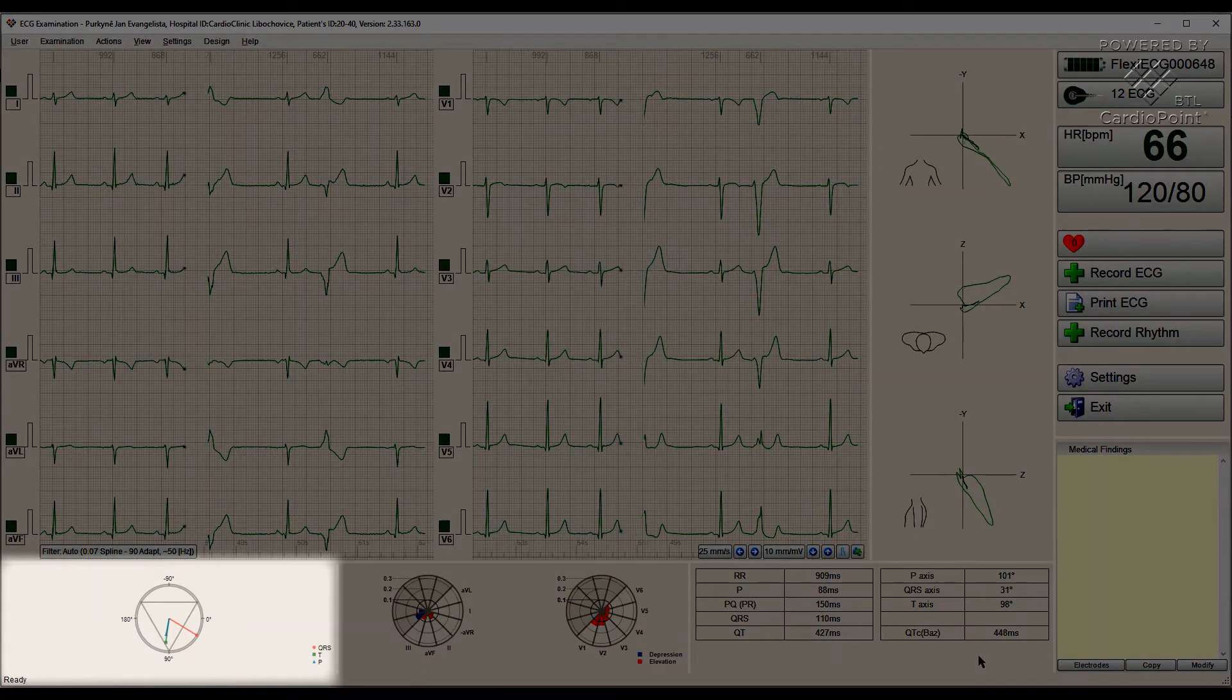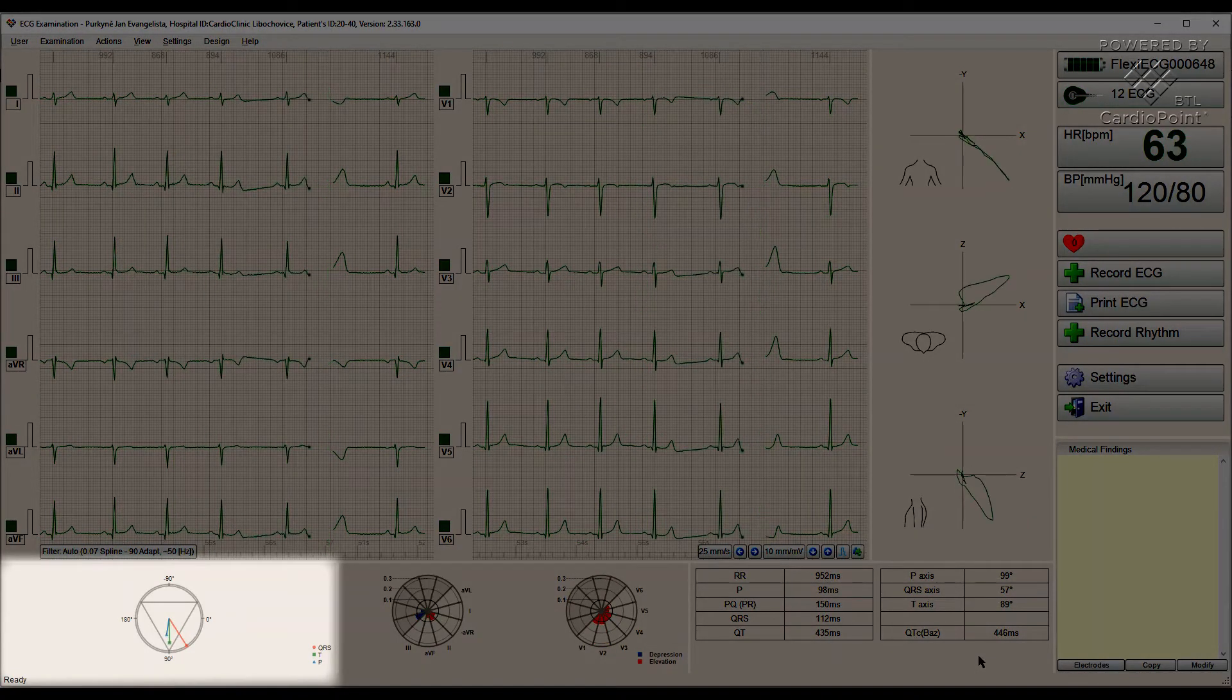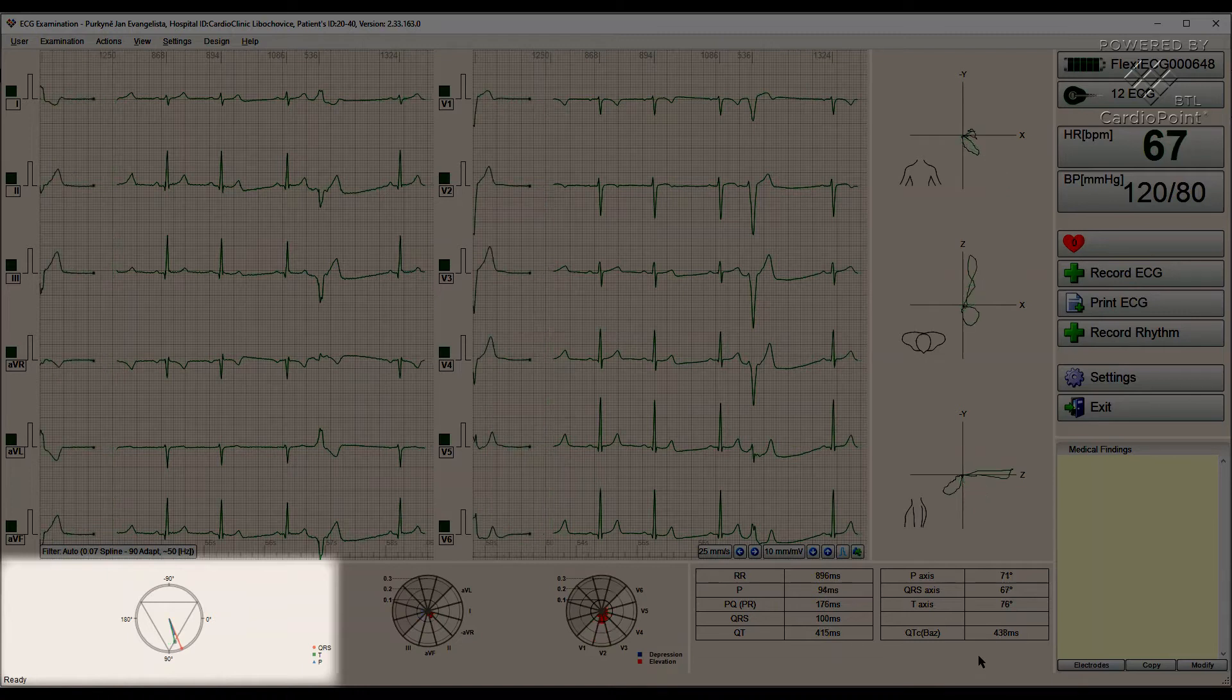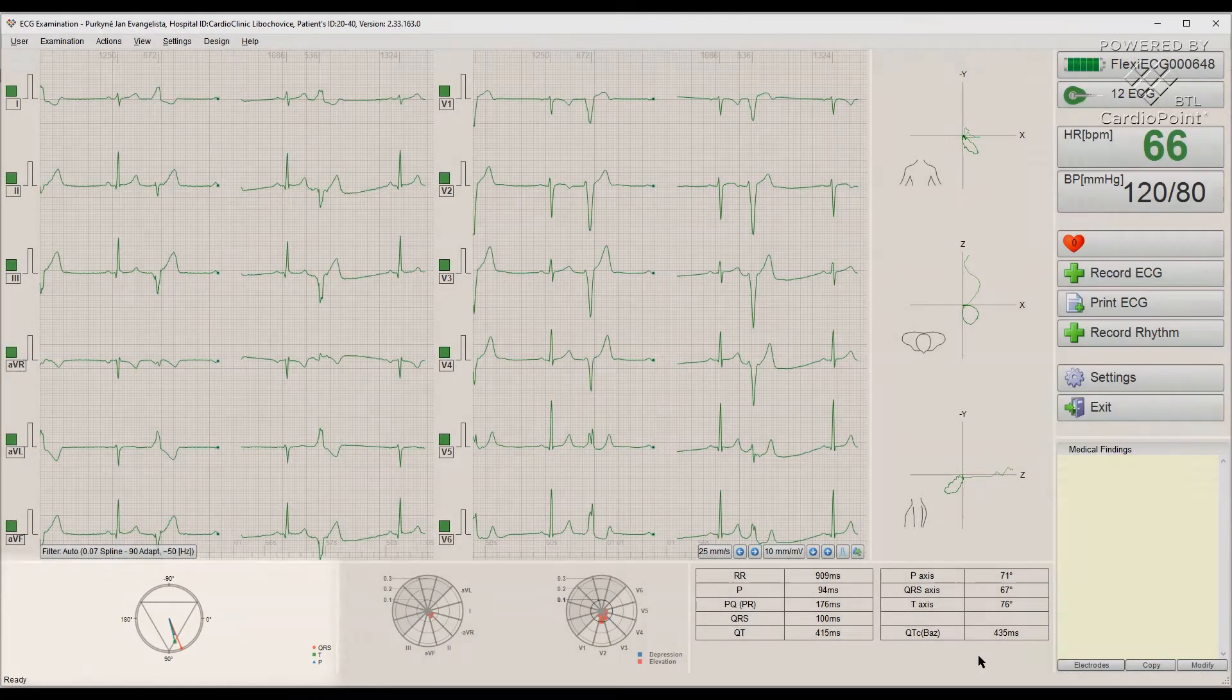Heart axis diagram shows us the current orientation of the QRS complex, T-wave and P-wave in the frontal plane.